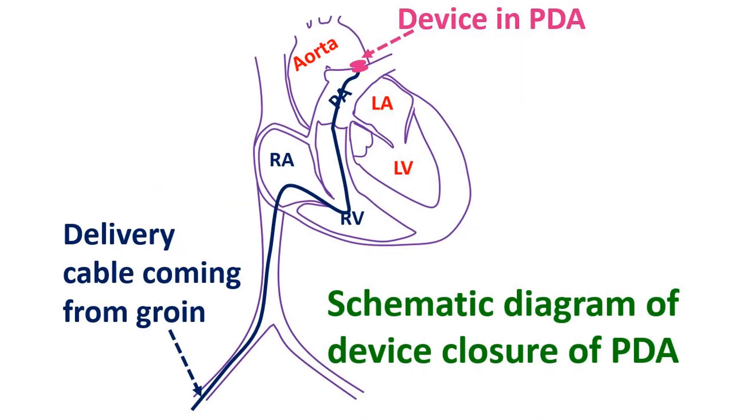Once the position of the device is confirmed and the shunt obliterated, the delivery cable is unscrewed and the device released. The delivery cable and sheath are withdrawn, as well as the pigtail catheter. Hemostasis is achieved by compression over the puncture site.